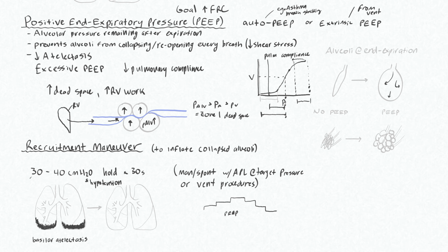These are also much higher pressures than you would consider using in someone who just had their lung operated on. Not to say that you'll be expected to manage those cases until further on in residency, but there's not necessarily a great one-size-fits-all recipe for a recruitment maneuver, but the 30 for 30 is at least something you'll find in textbooks, and acknowledging that it can cause hypotension and tachycardia and transient worsening of your hypoxemia, this is at least a reasonable template for your recruitment maneuver.